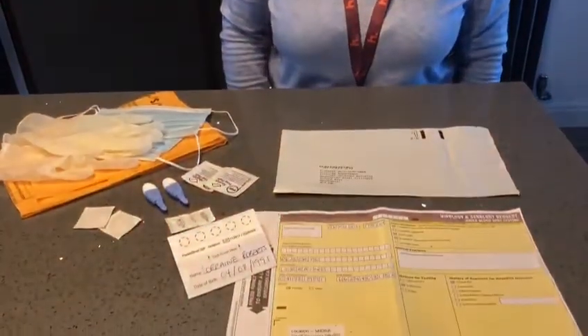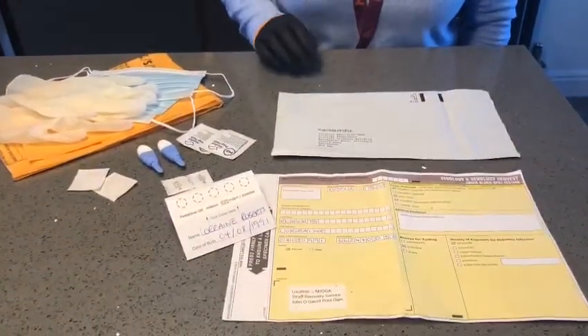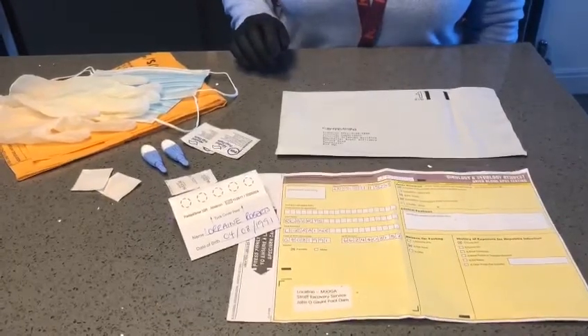So the first thing you're going to need is a kit that contains all the essential items. Everything comes in an envelope, and you have a request form.